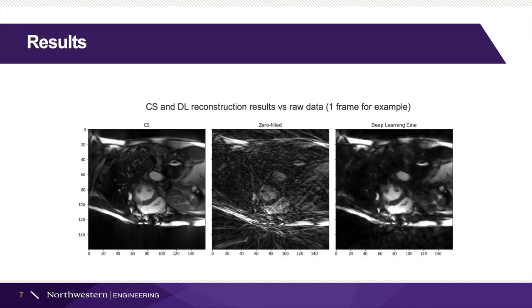Now let's have a look at our results. The left image is produced by compressed sensing, the middle one is the zero-filled input, and the right one is the output from deep learning.